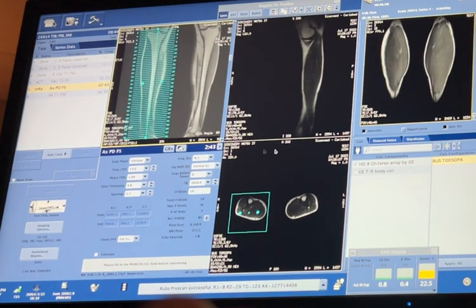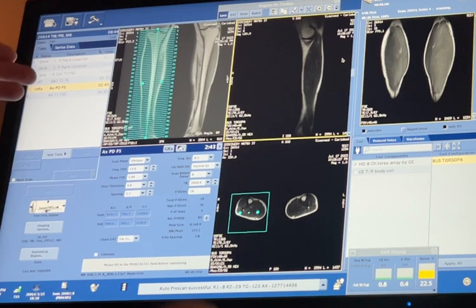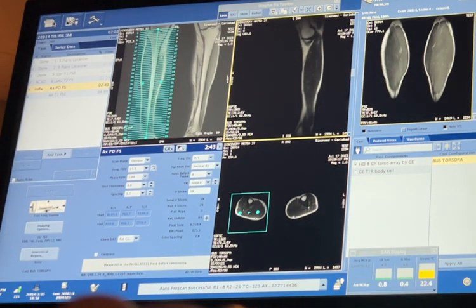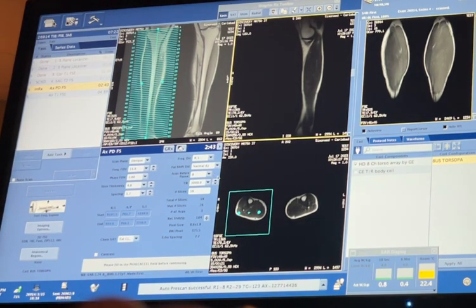There you go. So now we're going to get our new sagittal. We have to use that because we could see left to right where we are here, but we have to use the sagittal to see front to back, A to P. That way we can make sure our coverage is good. But it looks pretty big there, so I'm going to have you increase it by 1. Yeah, there you go. And now let's bring up the sagittal.